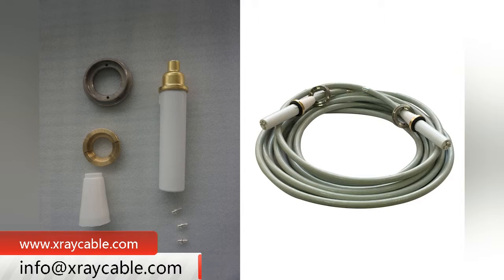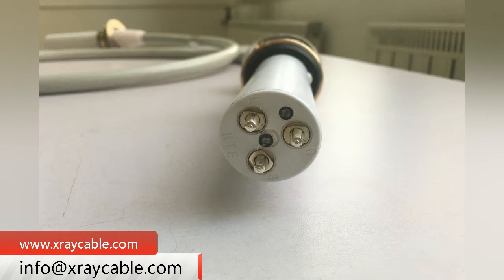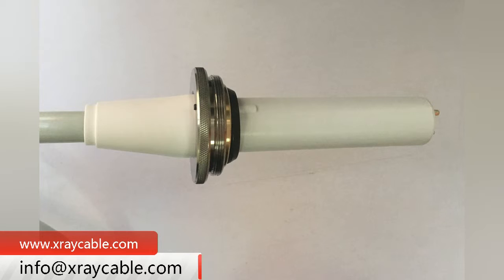The 8M75 KV X-ray High Voltage Cable can be used for X-ray machines, including Medical X-ray Machines and Industrial Non-Destructive X-ray Machines.